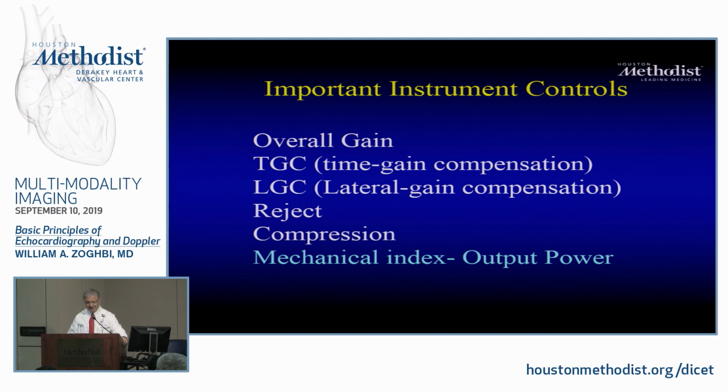It's nice to see that. Lateral gain, reject, compress. All these in white as opposed to the blue are post-processing of the ultrasound reflections that came back into the transducer. So the only thing that really changes is the output or mechanical index that you send. If you look at the MI, that's how much more power I send into this structure, into this chest. All the others are post-processing, so it's not going to hurt patients. That's why most of the regulation is in the MI itself.